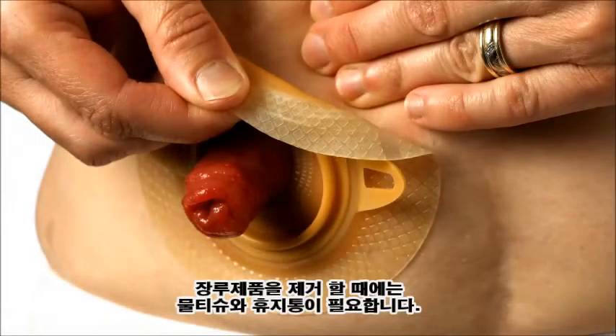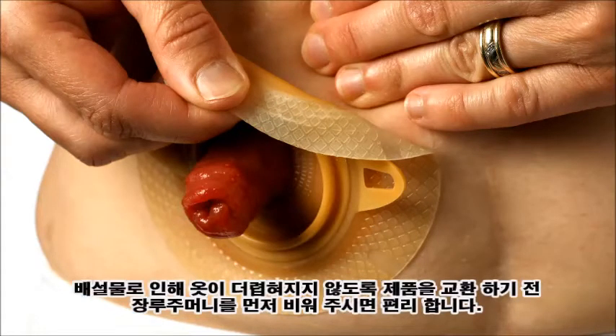To remove the ostomy appliance you will need water, cotton pads, a small towel and a waste bag. To ease disposal and to prevent potential soiling, you can attach the top of the waste bag in the band of your underwear right under the stoma.